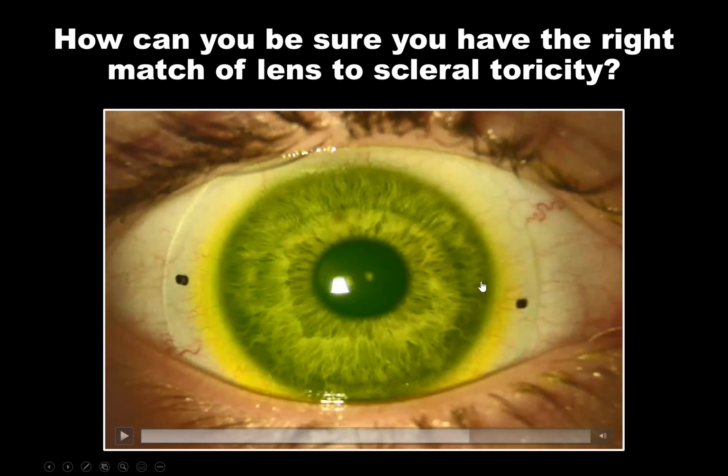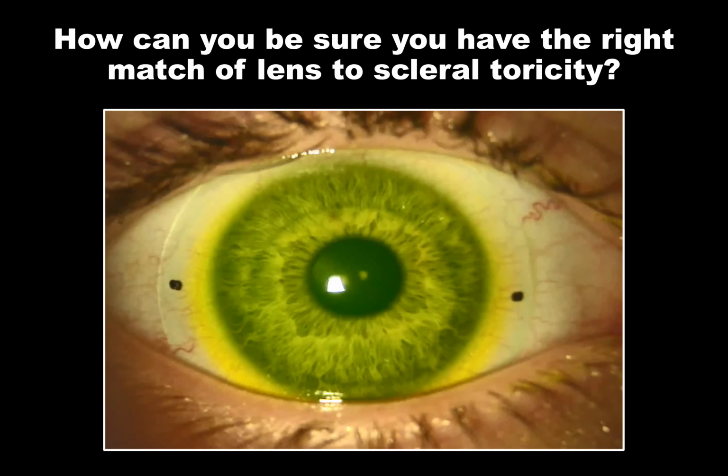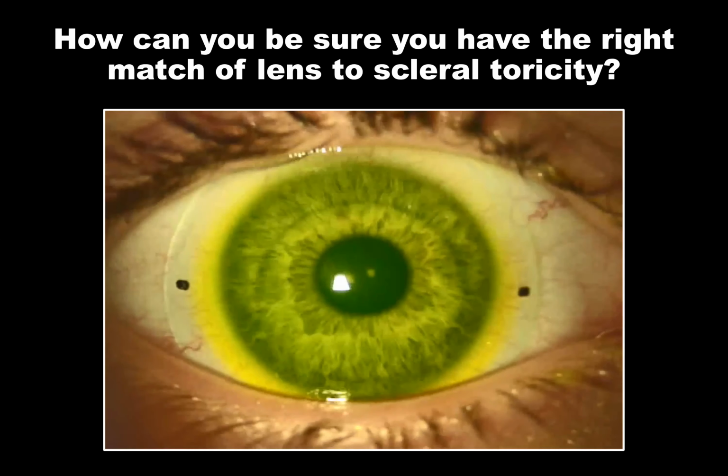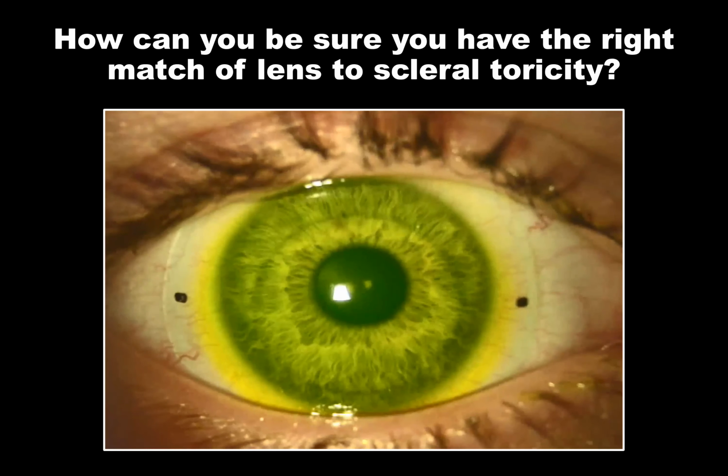Then you would denote where is the astigmatism. What sphere, cylinder, and axis do you have as an overrefraction? So it's not, again, this is a very important point. It is not important that these markers be at 0, 180. It's important that wherever they are, they're rotationally stable. And in this case, this patient has a with-the-rule scleral shape, but it could be almost any axis for the astigmatism that may be coming through.